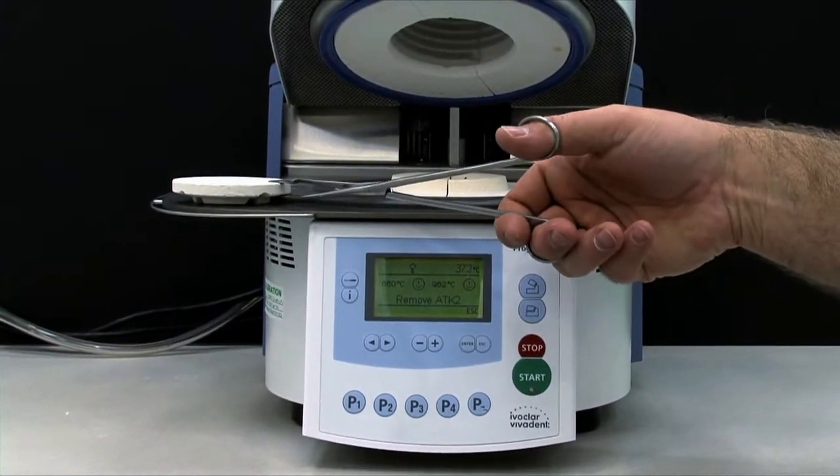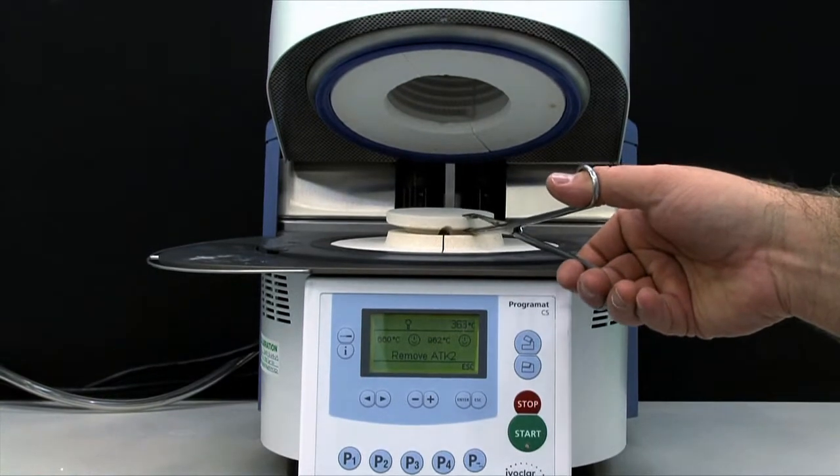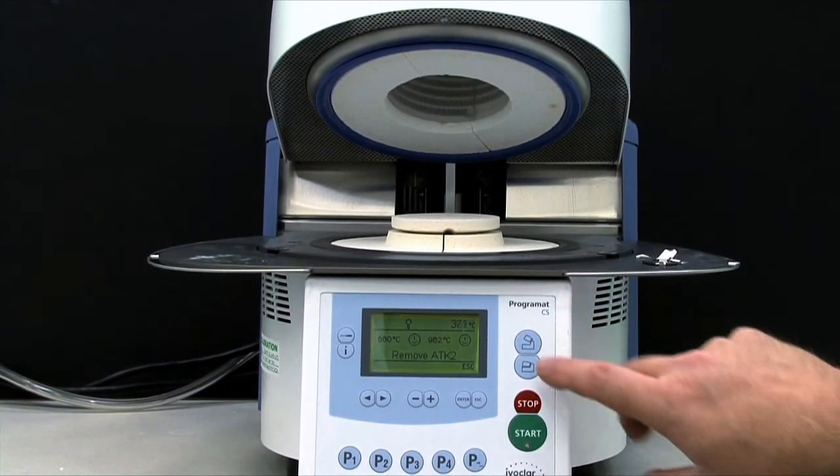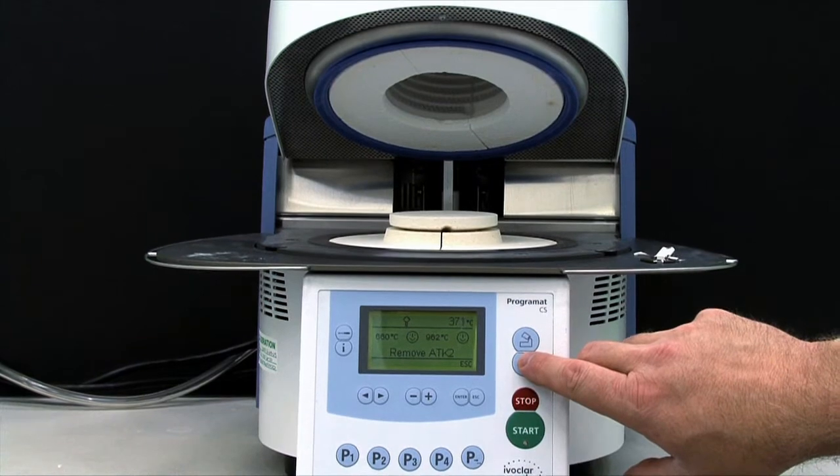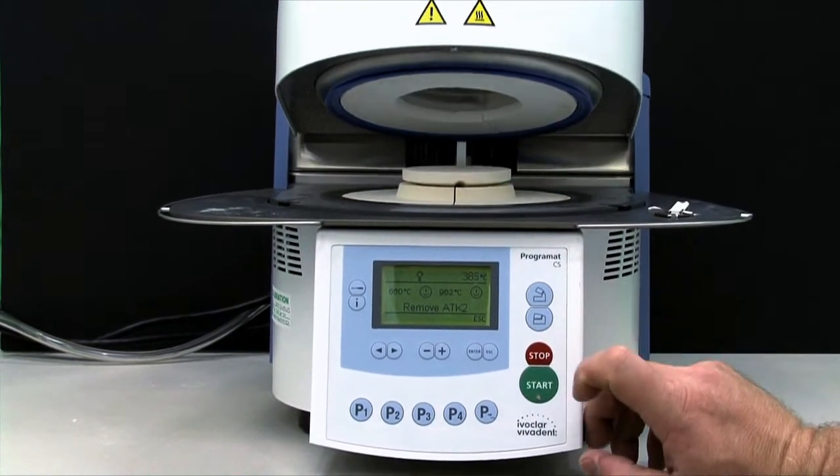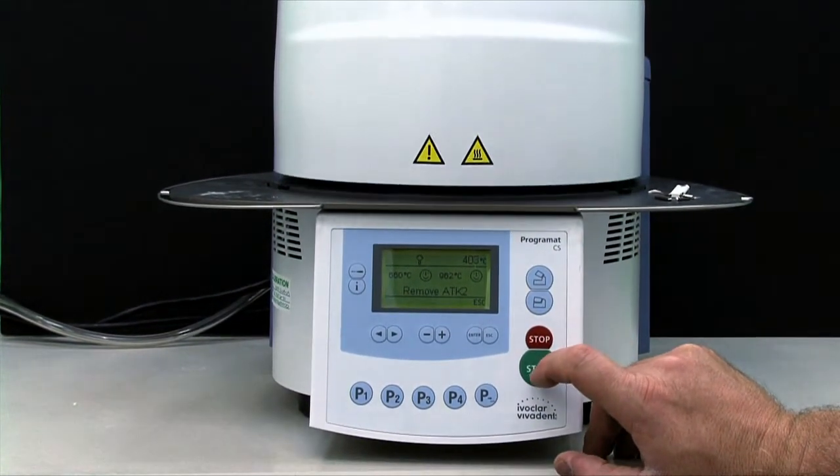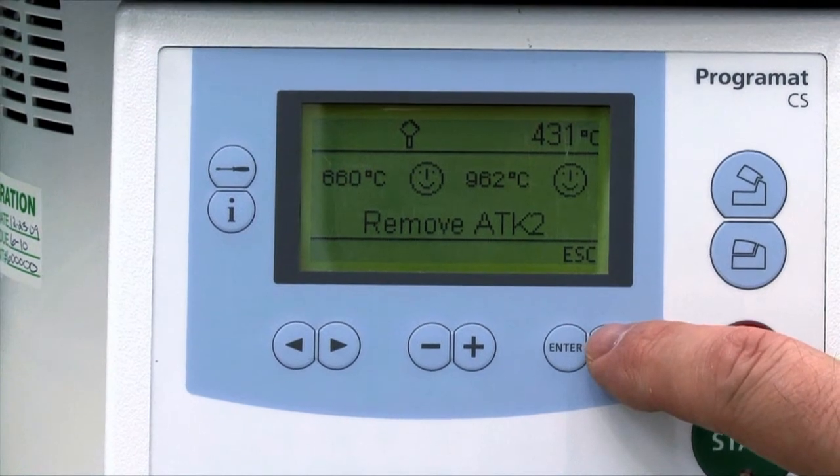Replace the firing plate and close the furnace head. Your program at CS is now calibrated and ready for use. Note the ATK2 can only be used once. Use a new ATK2 for the next calibration.